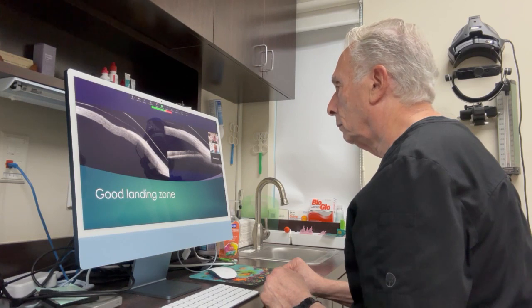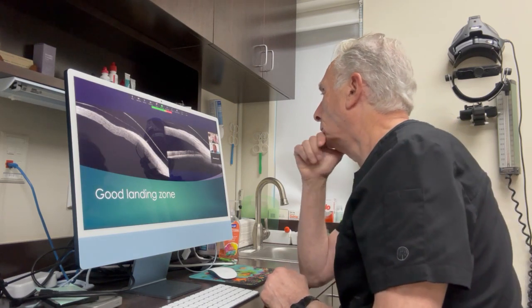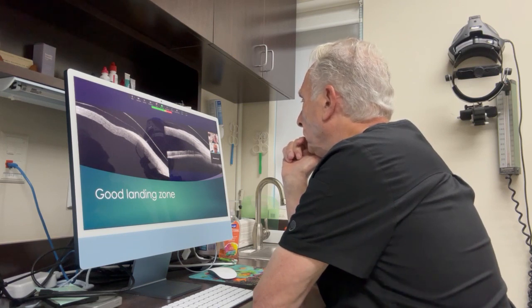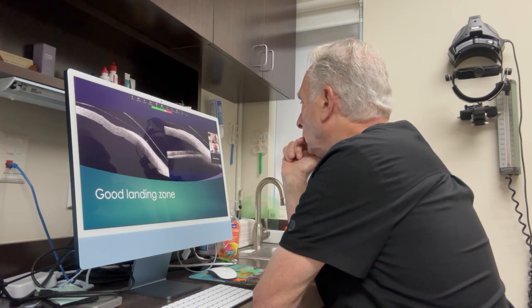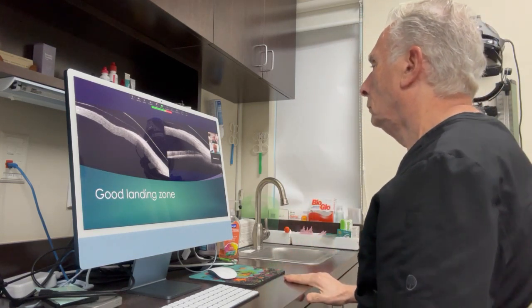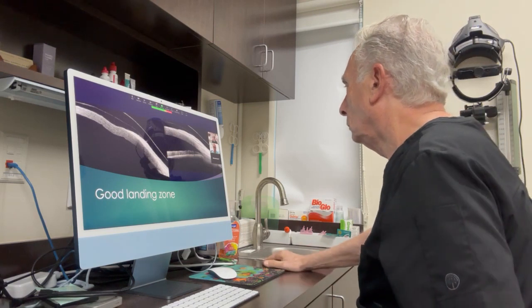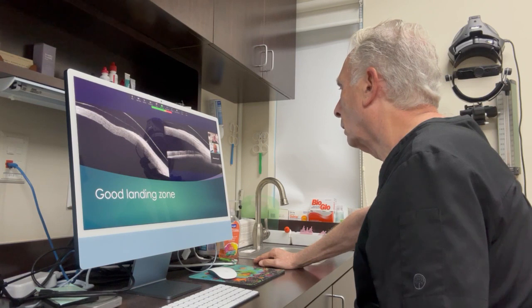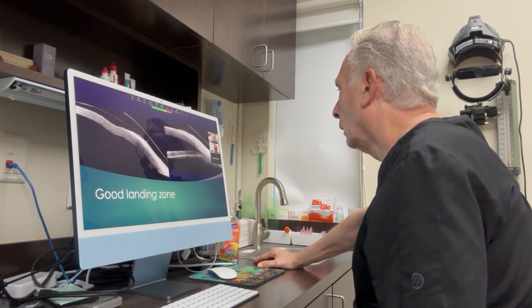Personally, I found that one of the difficult cases are pellucid marginal degeneration, because it's not so obvious to get the clearance at the bottom of the edge at 6 o'clock. You are using some new technologies, but we are using most of the time scleral lenses, which are not manufactured so precisely. So, what's your advice?